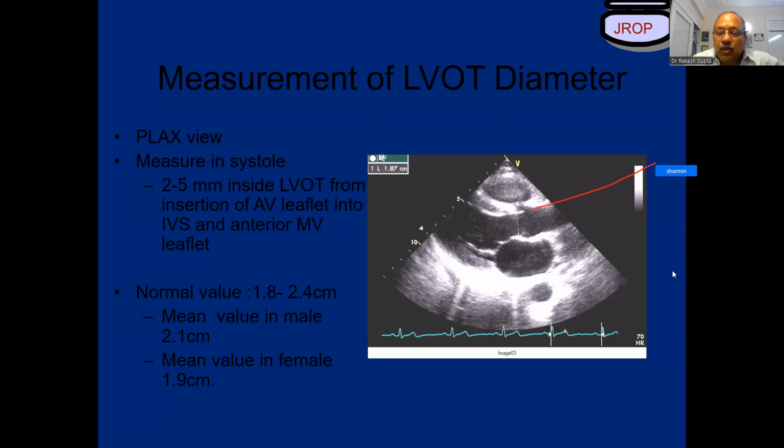This is very important because if you have to calculate the stroke volume, the LVOT dimensions would be pretty useful. The catch of this particular point is, how do you say this is the right coronary cusp and non-coronary cusp? Both of these leaflets should be opened up. They should be clearly seen, as you could see over here and over here.